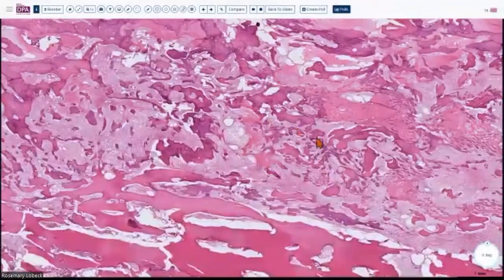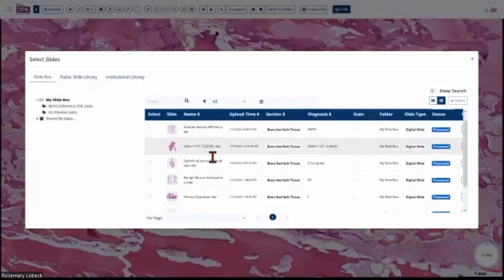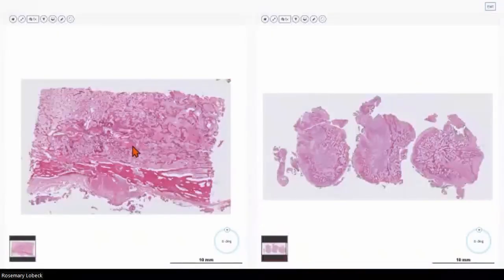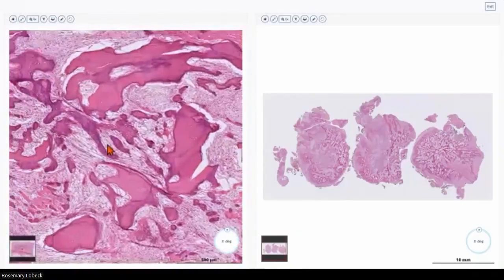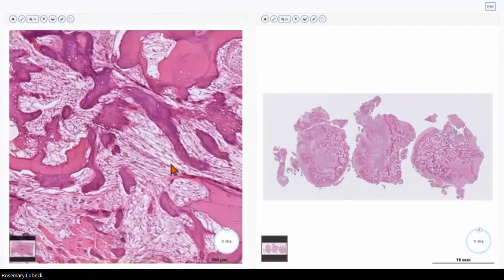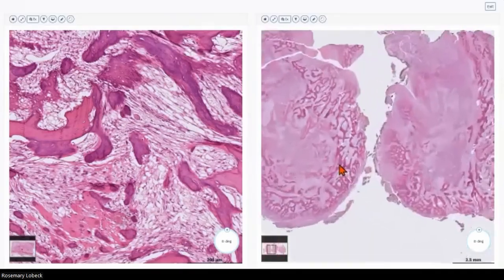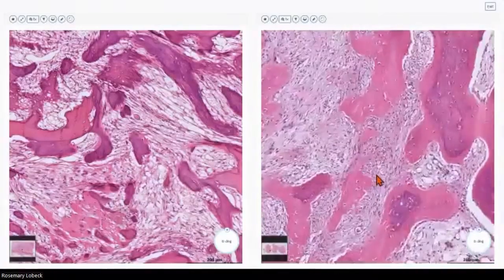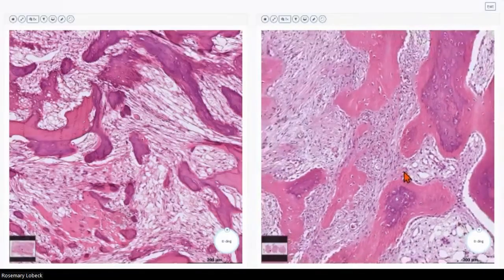So focus on this area here, right? So I'm going to pull up another case for comparison. This time it's going to be this one. So let's zoom in here. Okay, so you see these irregular trabeculae of bone, some of them broader, and then this fibrotic material here. And then you go into this case of myositis ossificans, just zoom in anywhere. And so you can see how hard it is on a biopsy or a curettage material to tell the difference between these two unless you have full clinical information.